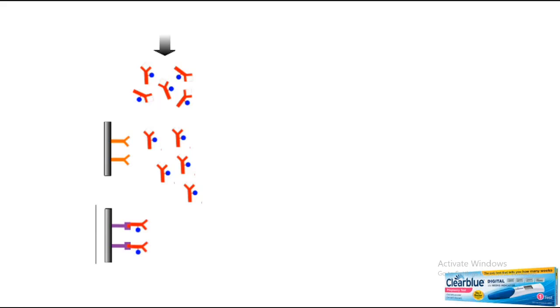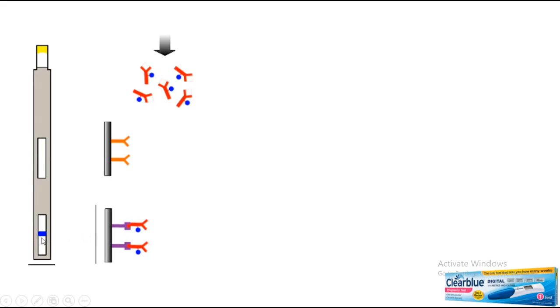So they move on and they eventually get captured by this antibody, okay? And what you then have is no binding here because there's no antigen, and you have binding here because the detection antibody has traveled its way through and gets captured here, okay? And that's why you'll see one blue signal for non-pregnant, when there's no pregnancy, because you're getting the enzyme reaction here, but not here.